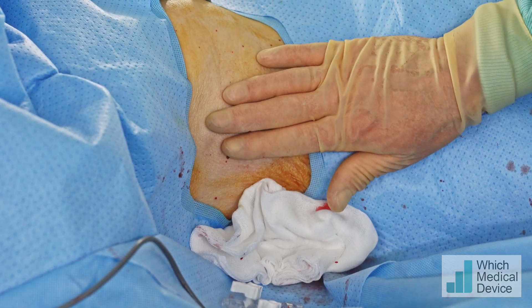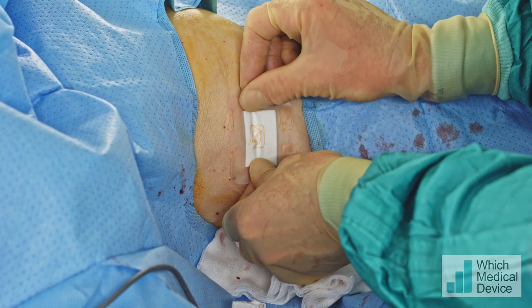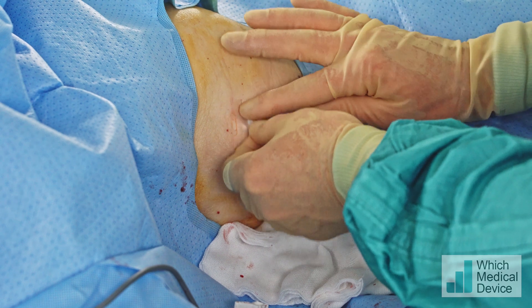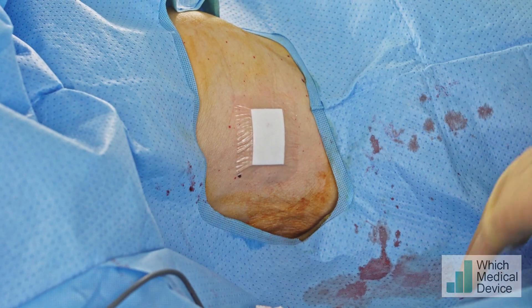And that's the procedure finished. All we'll do now is clean the skin and pop a little dressing on. Done.